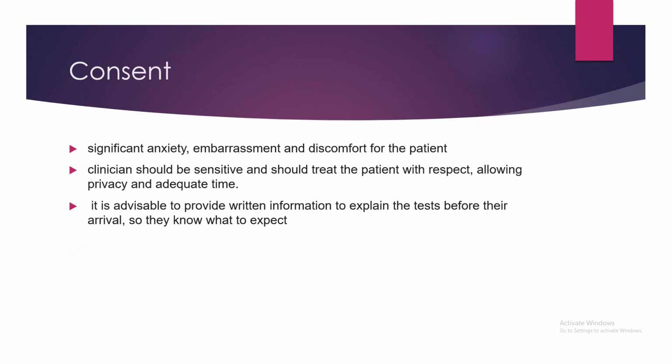Now you have to take consent. So while taking consent, you should remember that this test will cause significant anxiety, embarrassment, and discomfort for the patient. Okay, so the clinician should be very sensitive and should treat the patient with respect, and you should allow adequate privacy and adequate time. Otherwise, the results may be wrong. Okay, I will explain exactly what happens if the privacy is not there afterwards.